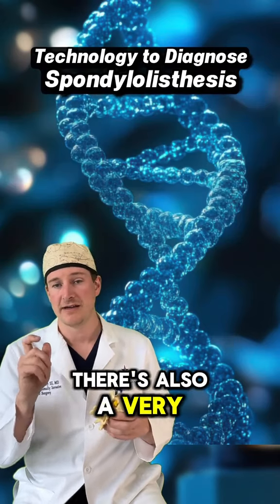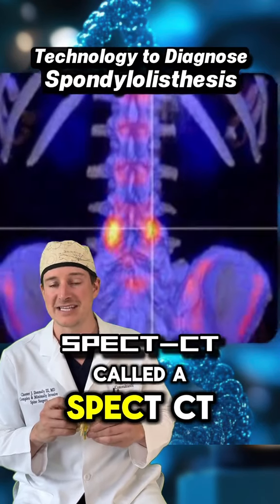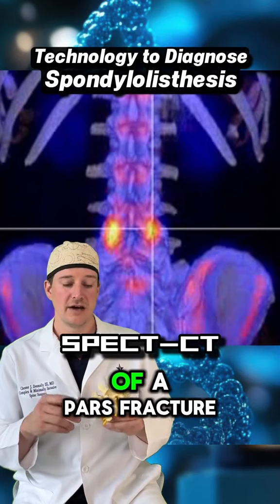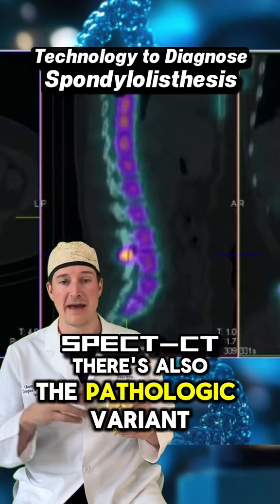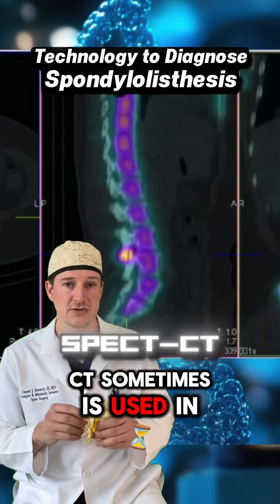There's also a very narrow subset of patients. I might order something called a SPECT CT. That might be useful in the early diagnosis of a pars fracture. There's also the pathologic variant I talked about earlier, and a SPECT CT sometimes is used in that setting.